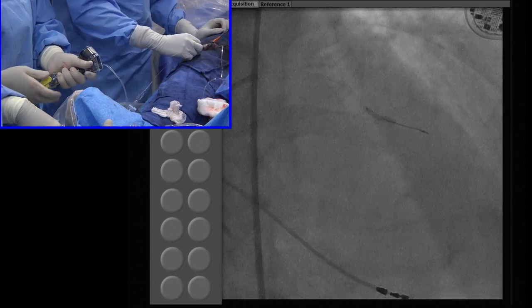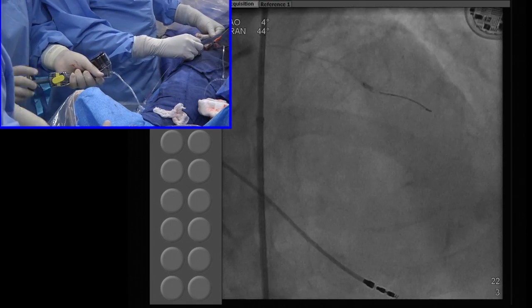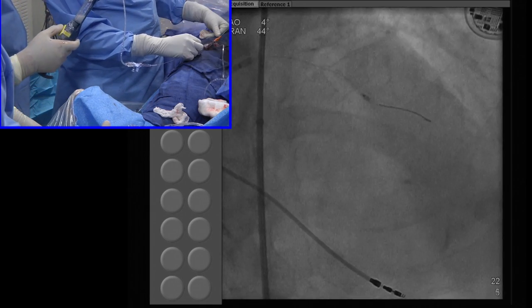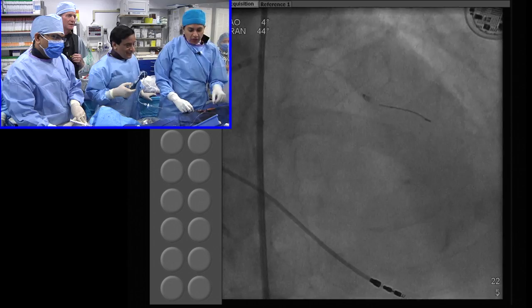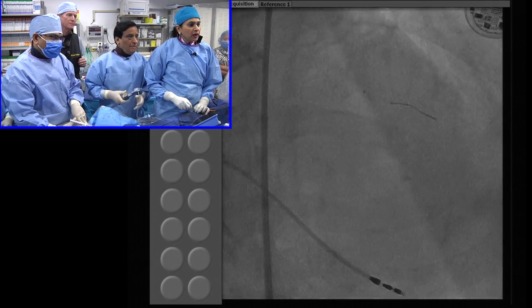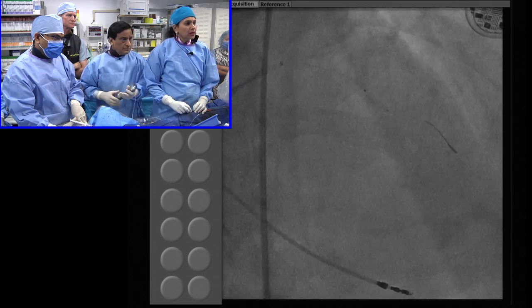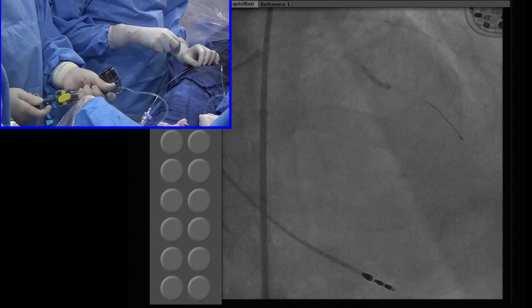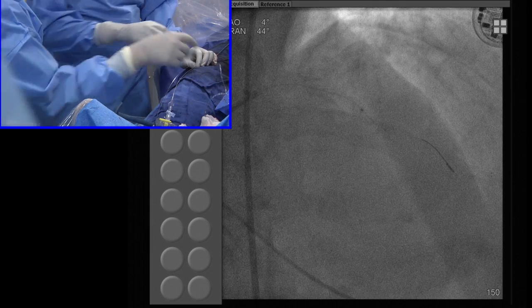I think what made it work was we went with the newer 2.5/12 balloon, and you saw as we were deflating the balloon, we just got the guideliner sucked in more. Sometimes that happens. I think it's a great teaching case. We actually knew that. Remember, even before we started, based on complexity, we wanted to make it a complex case, because otherwise all the teachings are there for a regular BVS deployment.